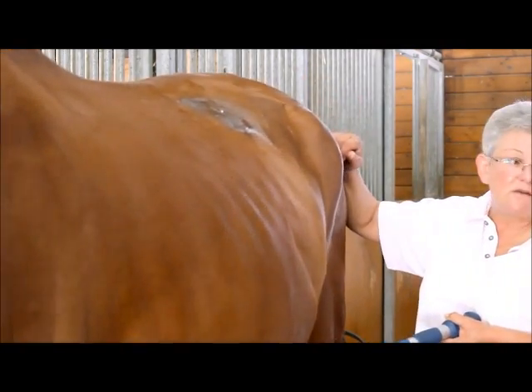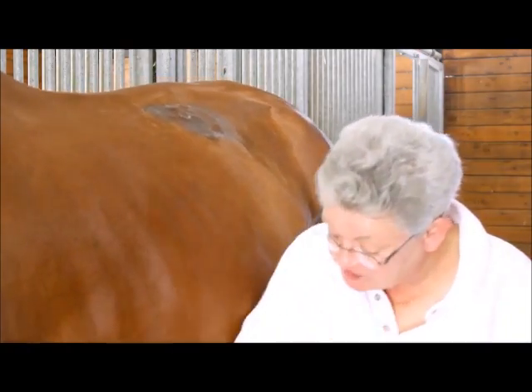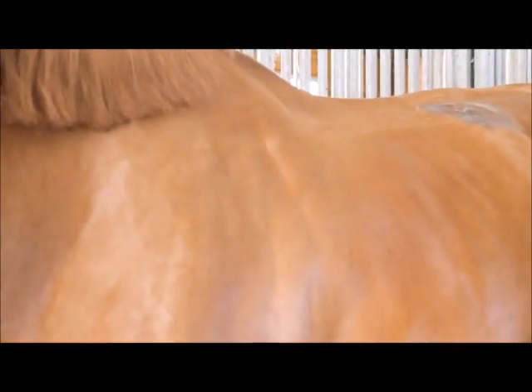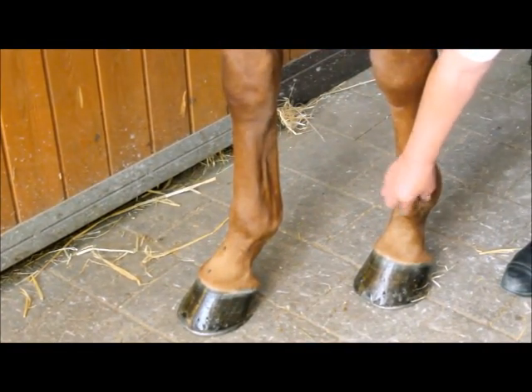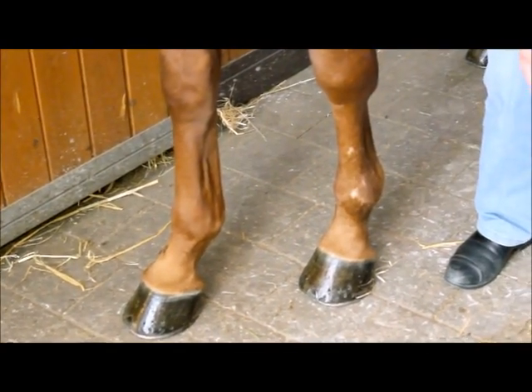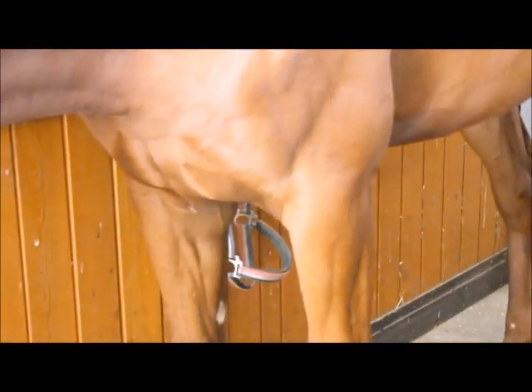He doesn't react a lot, so there is no need to go there. If I go to the leg, he has scar tissue here — he had an accident about two months ago. I go on the scar tissue to make it soft. You can see that it is not quite as flexible and soft as the other tissues. How many treatments have you done here? Three treatments so far.